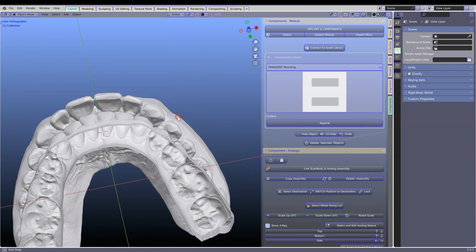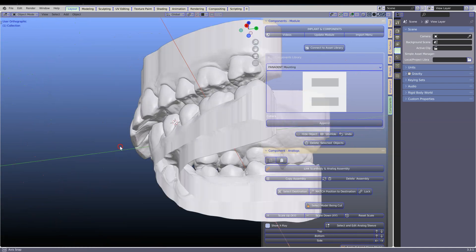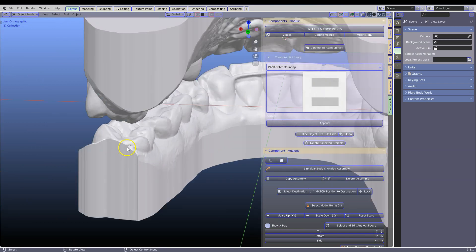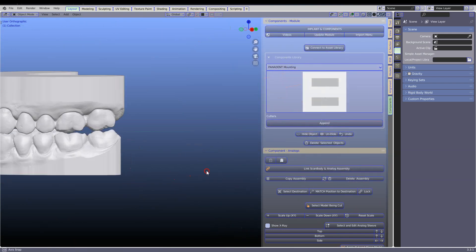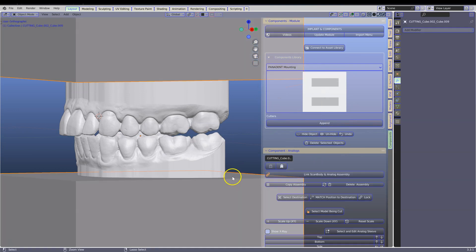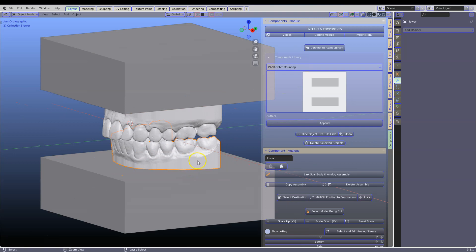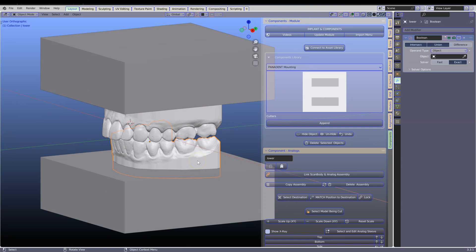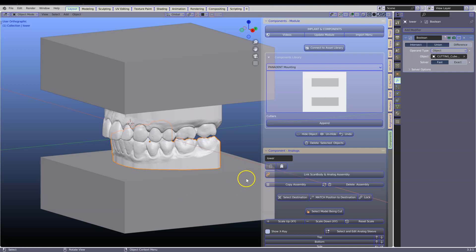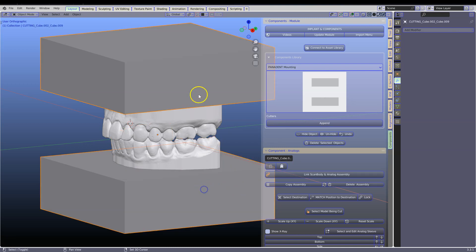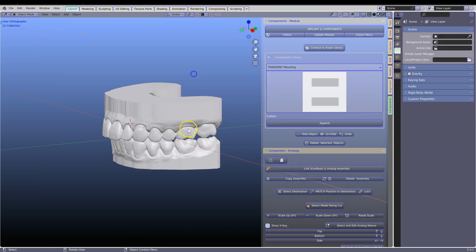Here we can see that we've had a boolean failure. This is probably due to the fact that the model is not nicely done. This is actually good that this has happened so that we can demonstrate what to do in that situation. Simply go back and instead of Fast, click on Exact. Take your dropper and cut it, then apply. Take these, X and delete.